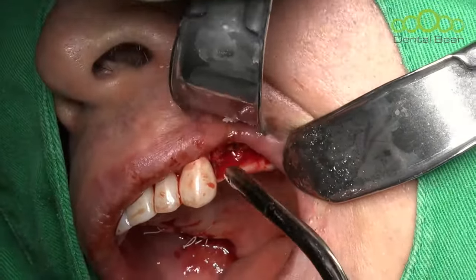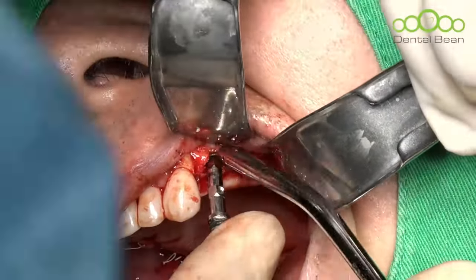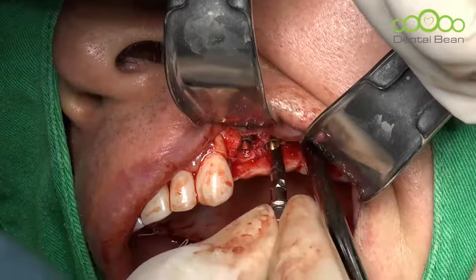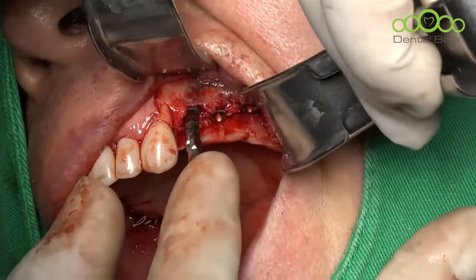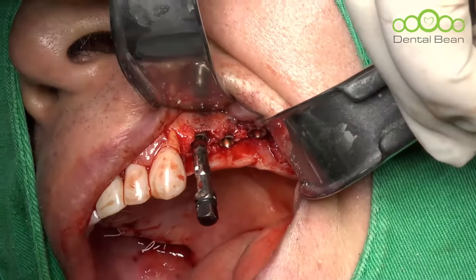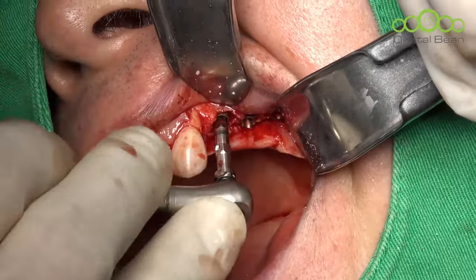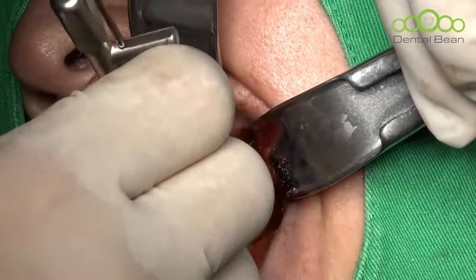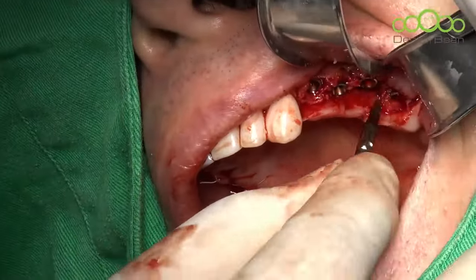Let me check. Hold on. Yeah. This one, second. Not bad. Even though I tried splitting, the buccal bone thickness looks not so wide. Because it's too dense a bone, it is difficult to control splitting. Anyway, let me check the condition.